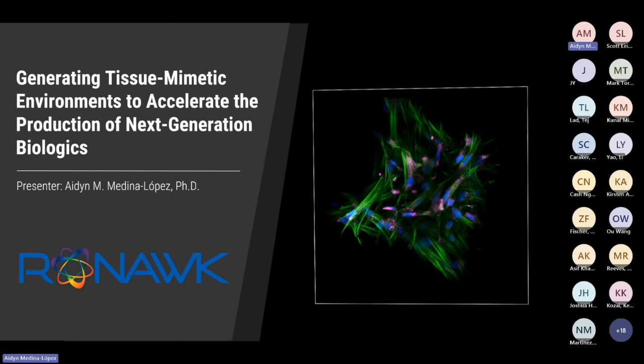So you will have to implement tissue dissociation techniques in order to get cells out of there. The younger the culture is, the easier it is. It takes around 2 hours to dissociate completely the block and get out the cells. Normally, the viability of those cells is retained in between 98 to 99%.